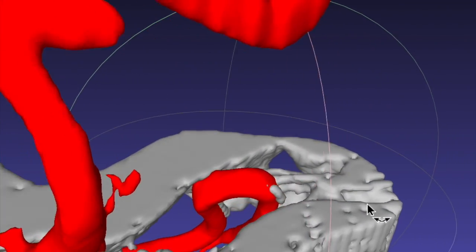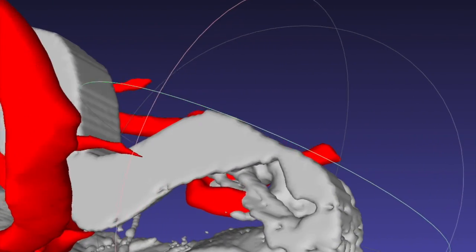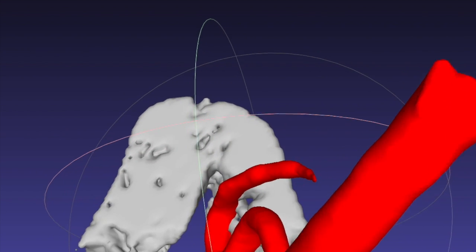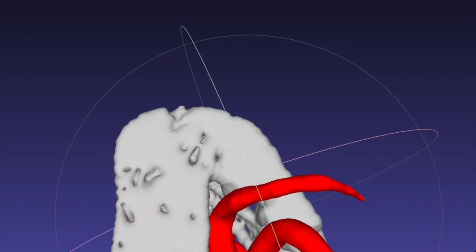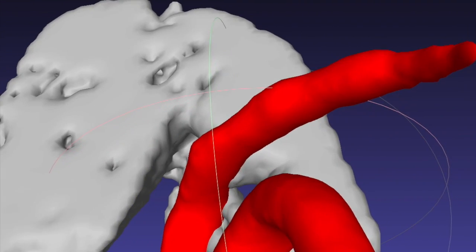The last case exemplifies a pitfall of hemifacial spasm microvascular decompression. That is, the nerve in this case is compressed, but so is the attached segment of the facial nerve. Simple decompression of the nerve without brainstem decompression may not result in durable improvement.